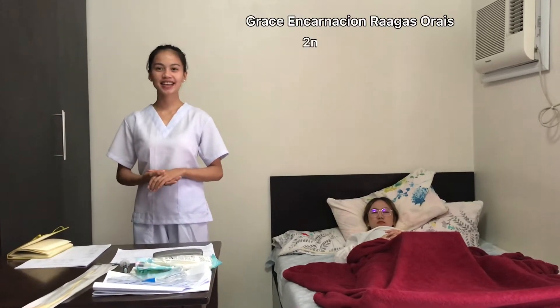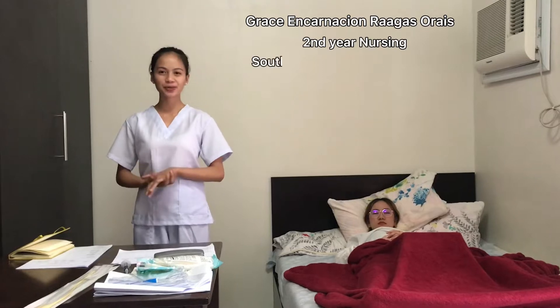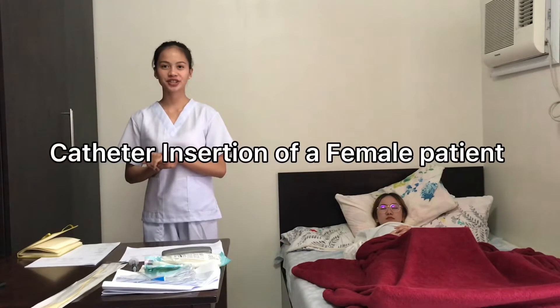Hi, I am Grace Incarnacion Raagas Urais, a second year nursing student from Southwestern University FINMA. And today I am here to perform the catheter insertion.